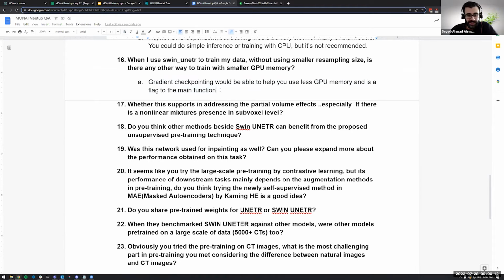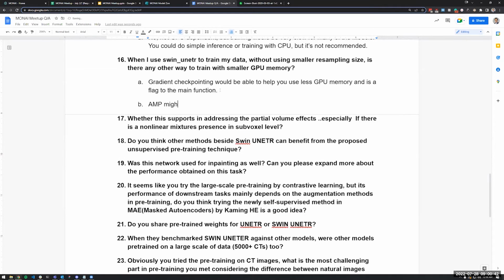So it's true. Automatic mixed precision is also in there, but there is a specific hint when you look at the arguments for the command line call, that you should not use AMP for training. I'm not really sure why. Would be interesting to ask the authors, but it's basically recommended to not switch this on for training. Okay, we're going to have to circle back to that because we've encountered this with other networks, and that's something we should figure out, because I think it'd be very helpful.